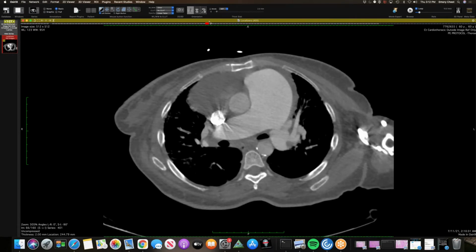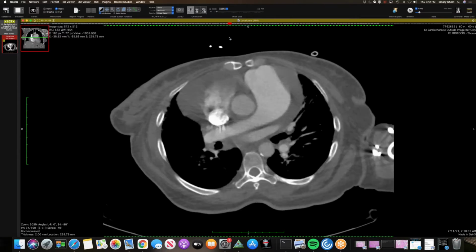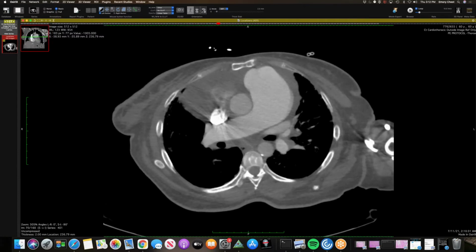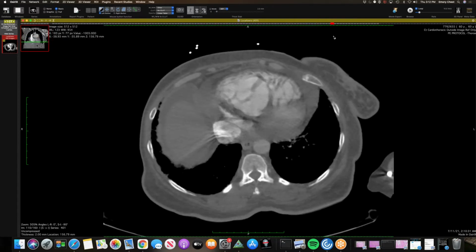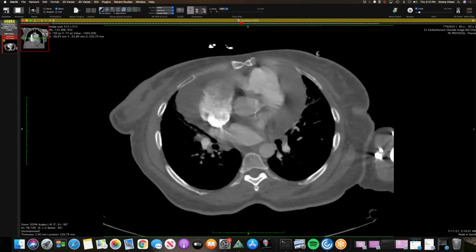Yeah. And I have to say, I have seen some lupus cases with big PAs and pulmonary hypertension. It's less common than scleroderma. It is technically under the PAH category. It's just much less common than in scleroderma, but most of the cases with bad PA, I mean, this is awful, usually have CTEPH. But it's hard to tell from the scan.